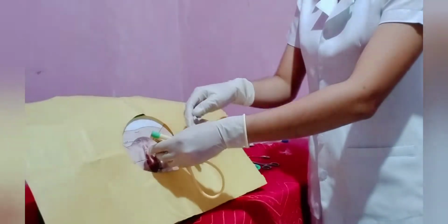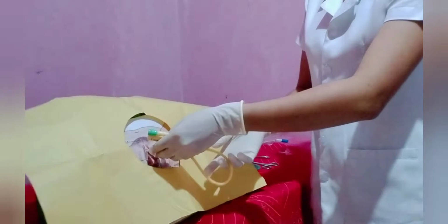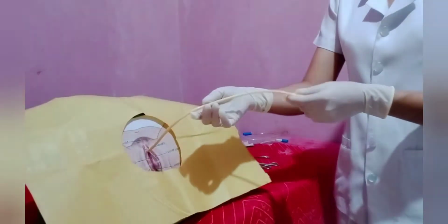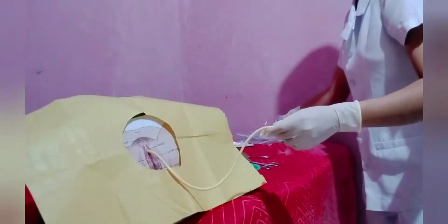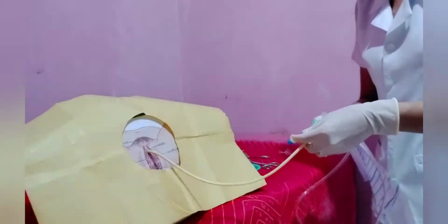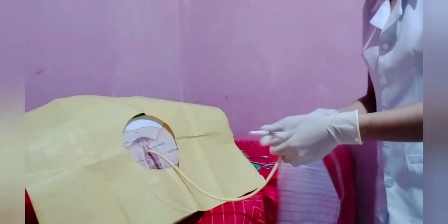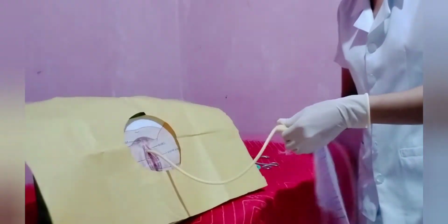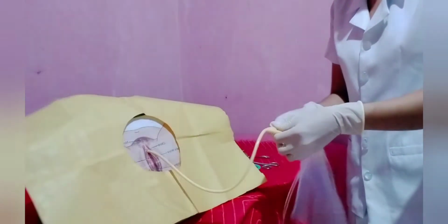After that, you have to connect the catheter to the urine bag so that the urine will not leak from the bag and to maintain its sterility. So I have here the urine bag. So I will connect it now. So now we can let it go.